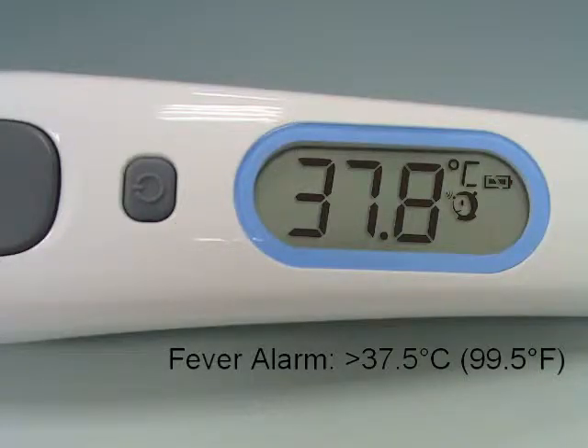If the thermometer detects a temperature greater than 37.5 degrees Celsius or 99.5 degrees Fahrenheit in forehead mode, three short beep sounds will follow one long beep sound to warn the user of a potential fever.